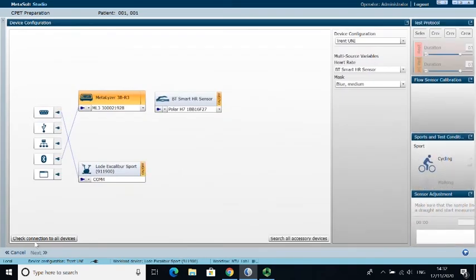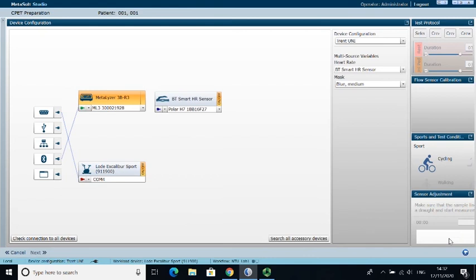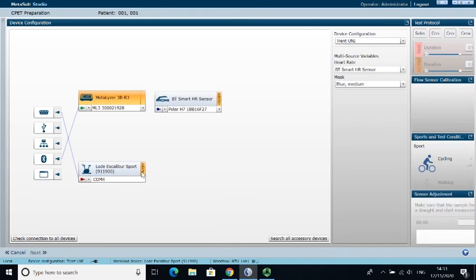So we can see that's what I've done here. I've gone onto this screen and selected to do a Lode Excalibur Sport bike. And all I'm doing in this part here is just making sure that the software is talking to all the different pieces of kit that I need it to. So you can see it's talking to the Metalyzer, which is the breath-by-breath gas analyzer, the bike, the Lode Excalibur Sport, and then also the heart rate monitor. And so once I know it's talking to all of these things correctly, then I'm happy that it's going to run these machines, and therefore I won't have to collect information on them separately.